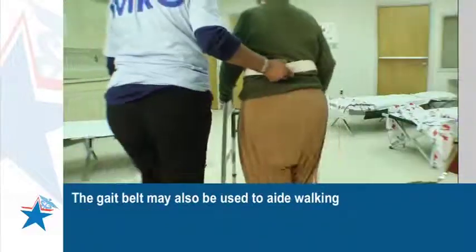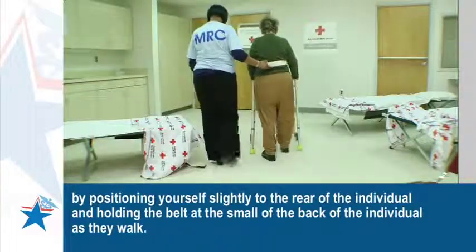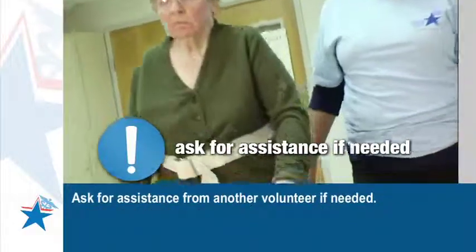The gait belt may also be used to aid walking by positioning yourself slightly to the rear of the individual and holding the belt at the small of the back as they walk. Ask for assistance from another volunteer if needed.